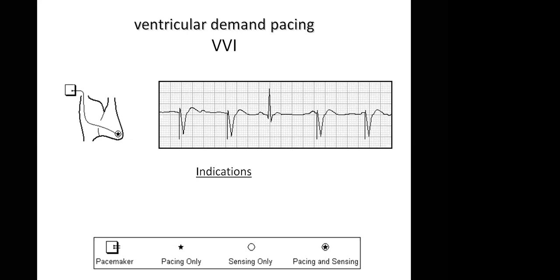Justify what ECG tracing you are seeing and justify the mode. Okay, so this is a ventricular pacing. The first spike is a pacemaker spike seen before the first QRS. There are two QRS complexes that are paced, following which there is an intrinsic activity. So there's a normal QRS there, but it still paces after the intrinsic activity. You can see my arrow. That's intrinsic activity. I said it still paces afterwards, but there's a refractory period. Yes, correct.